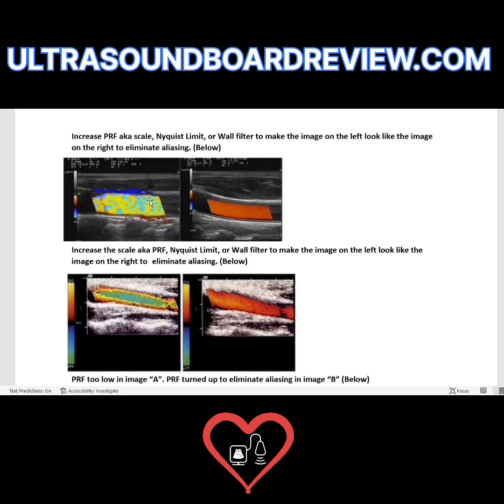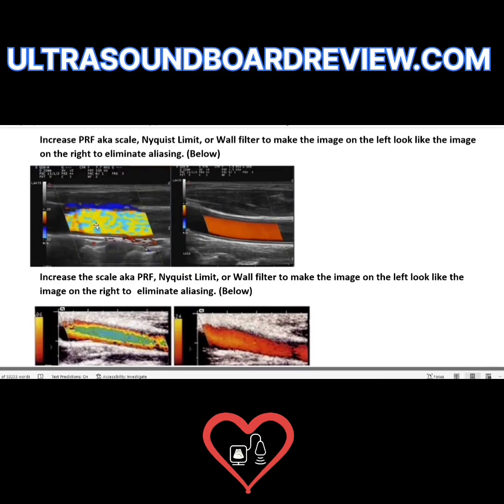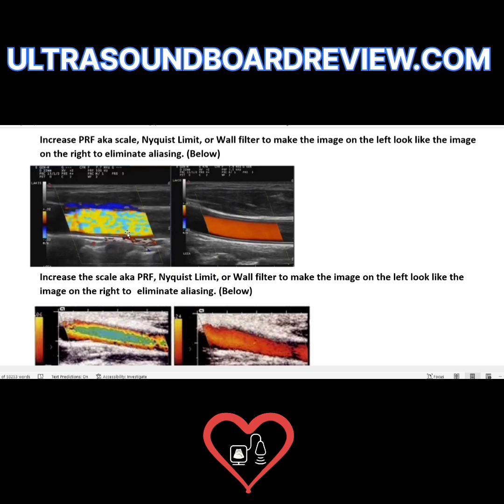Here we see color aliasing, which is the result of your scale, PRF, Nyquist limit, and wall filter all turned down too low.